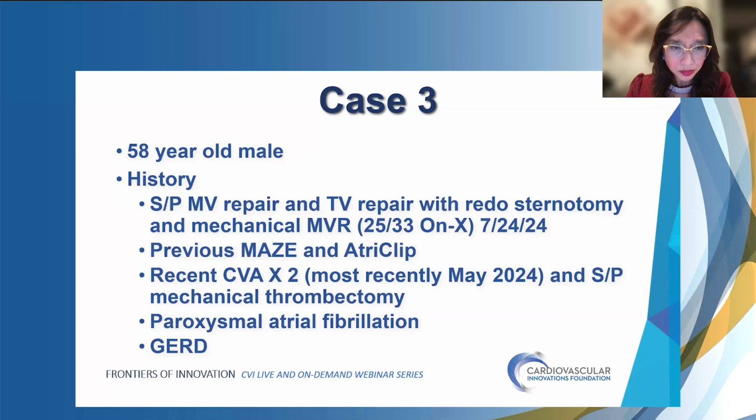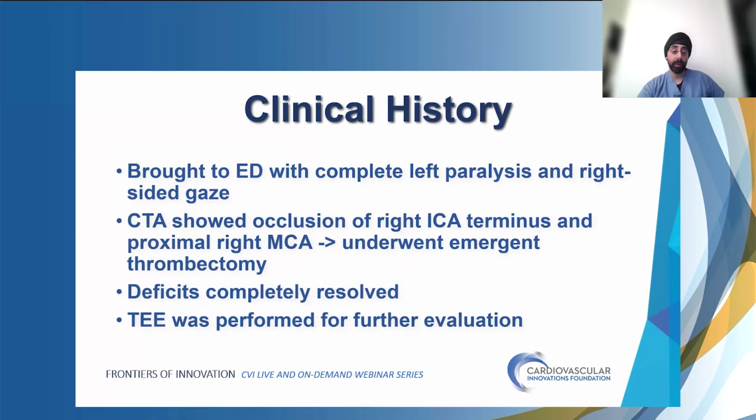Next slide. And not to interrupt you, Nadira, but this is exactly what we're talking about, this changing landscape of what we see. Look at how many devices and surgeries and procedures this patient has had. How attractive would a redo operation be for somebody like this? And he's only 58. So clearly there's an unmet need.